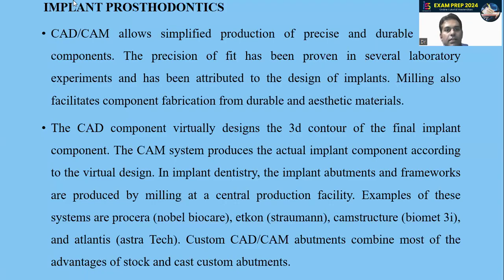Now the next is application of CAD CAM in implant prosthodontics. CAD CAM allows simplified production of precise and durable implant components. The precision of fit has been proven in several laboratory studies and has been attributed to the design of implants. Milling also facilitates component fabrication from durable and aesthetic materials. The CAD component virtually designs the three-dimensional contour of the final implant component. The CAM system produces the actual implant component according to the virtual design.